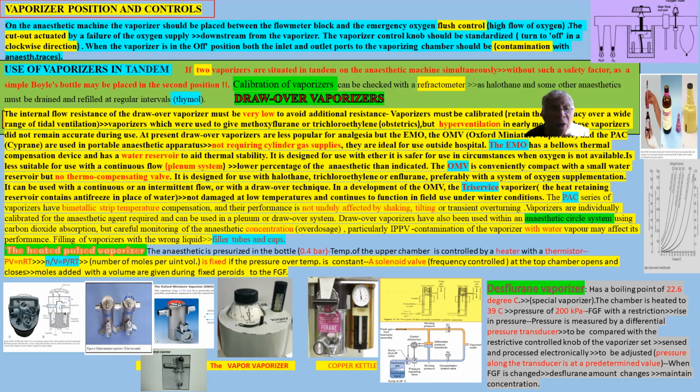The point is that we are utilizing the common gas law, which we denote as PV equals nRT. So if we rearrange, we find n over V equals P over RT. So if we assure that the temperature is constant, we will find from this equation that we can keep n over V constant, as long as the other side of the equation is constant.